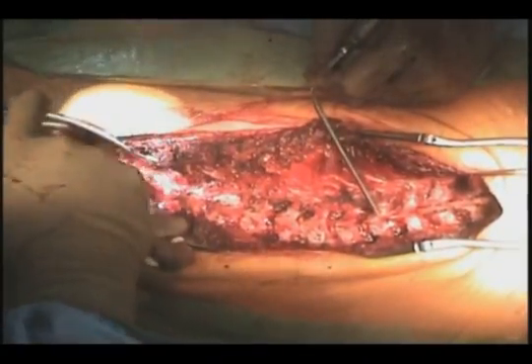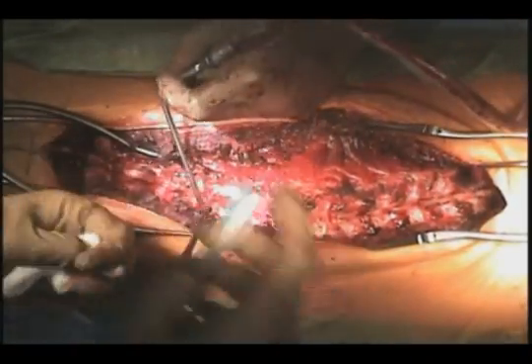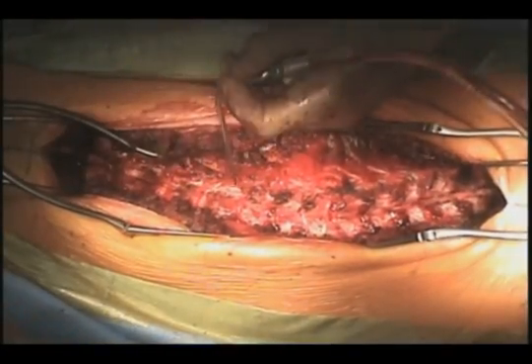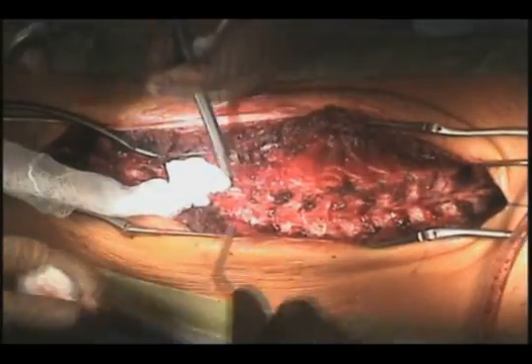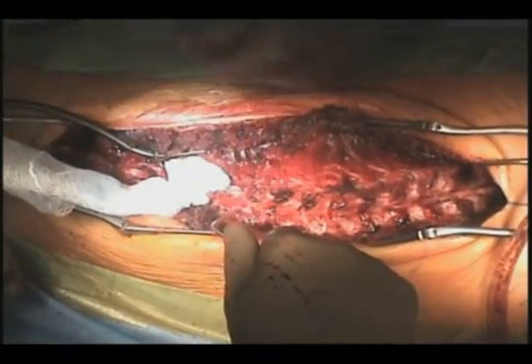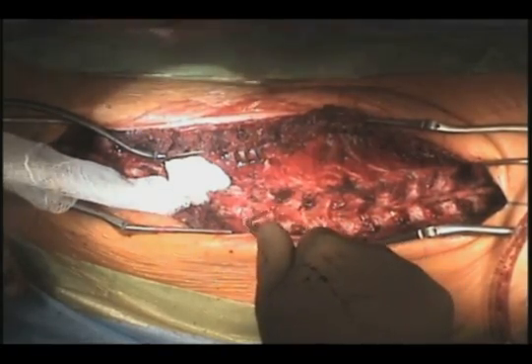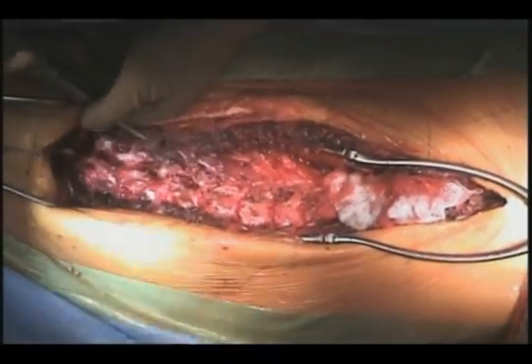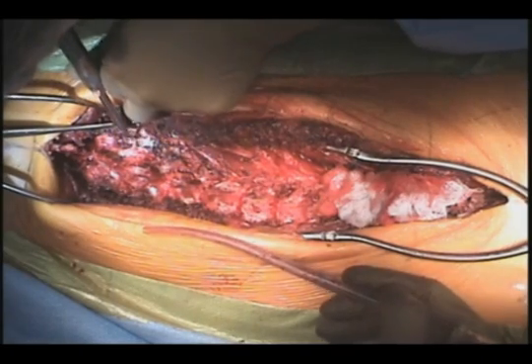This was described by Alberto Ponte originally for Scheuermann's kyphosis, for a shortening procedure, and we do this to enhance correctability of the spine in the coronal, sagittal, and axial planes, but especially for the coronal correction and for allowing us to lengthen the posterior column. So by lengthening the posterior column, we can restore kyphosis. And as I do these osteotomies, we apply a collagen thrombin combination for hemostasis.